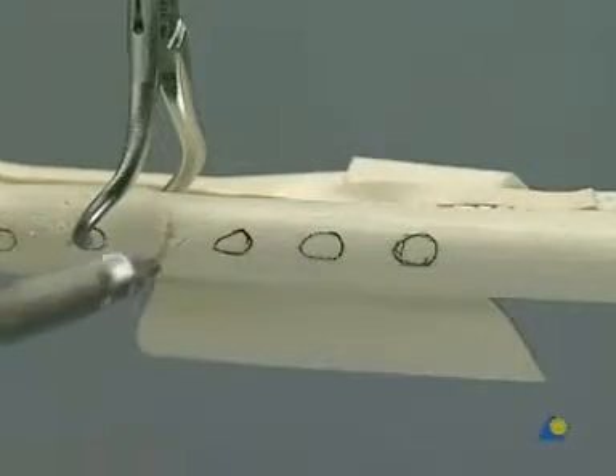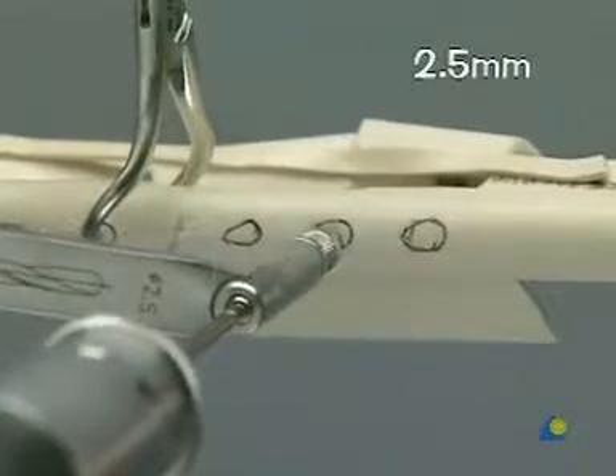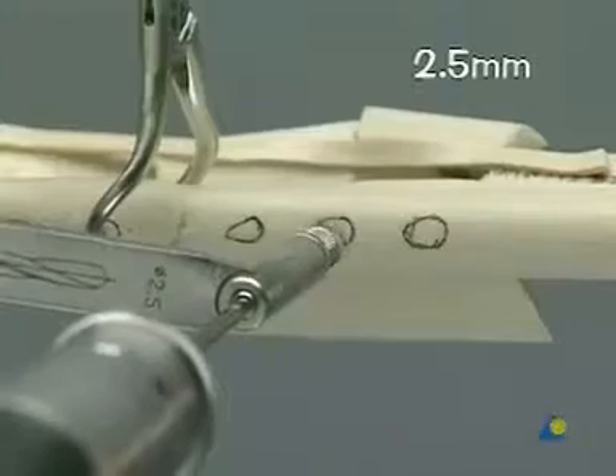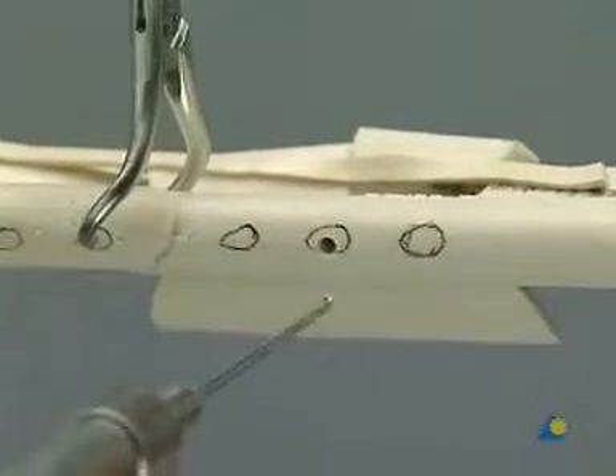With the universal drill guide and a 2.5 mm drill bit, a proximal hole is made at the previously selected site. It is measured and tapped with a 3.5 mm tap.